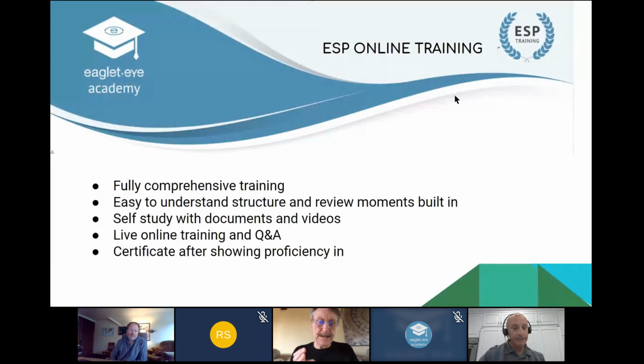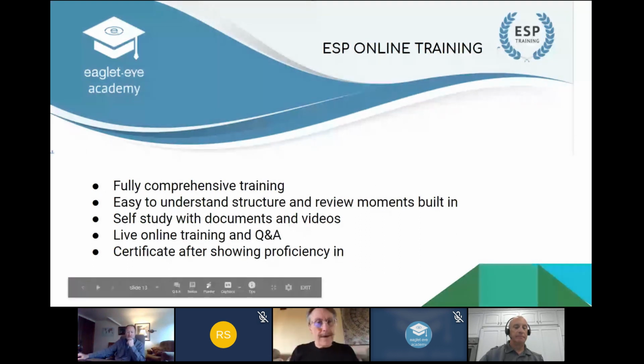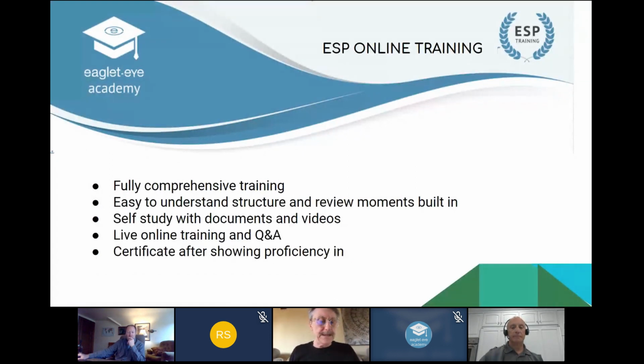It's amazing. That's great. And there is that extra added theatre, because keratoconics like what they see on a corneal topographer, but when they see it in the 3D models, which you can kind of do, which is not necessarily super helpful when we're doing clinical fit and algorithming into the lenses, but for a patient to see it, oh my God, I realize this is why you're having such challenging fits, or why my lenses have never fitted historically.